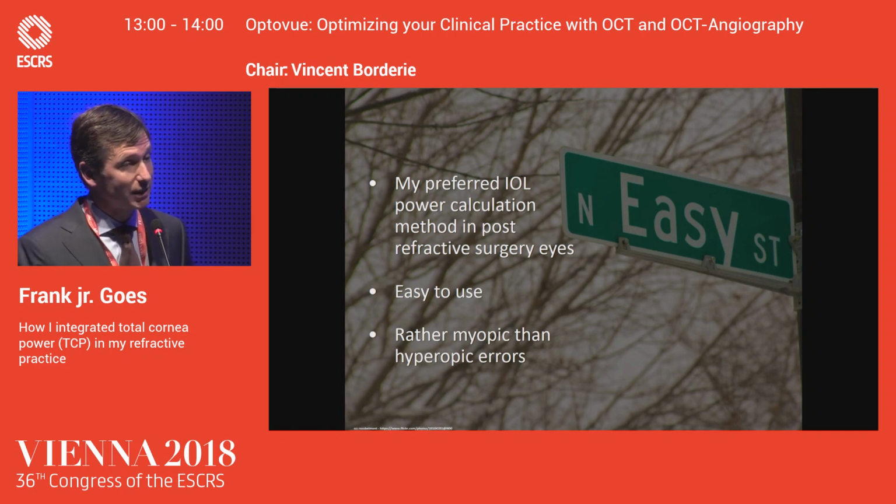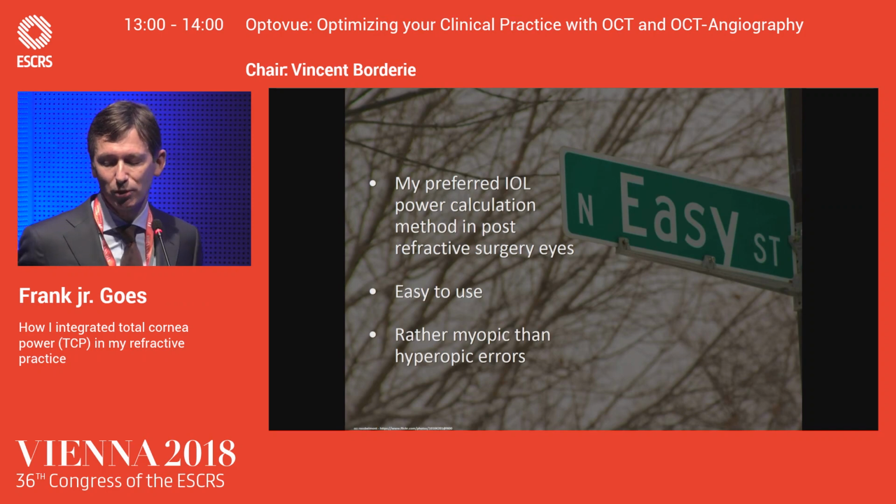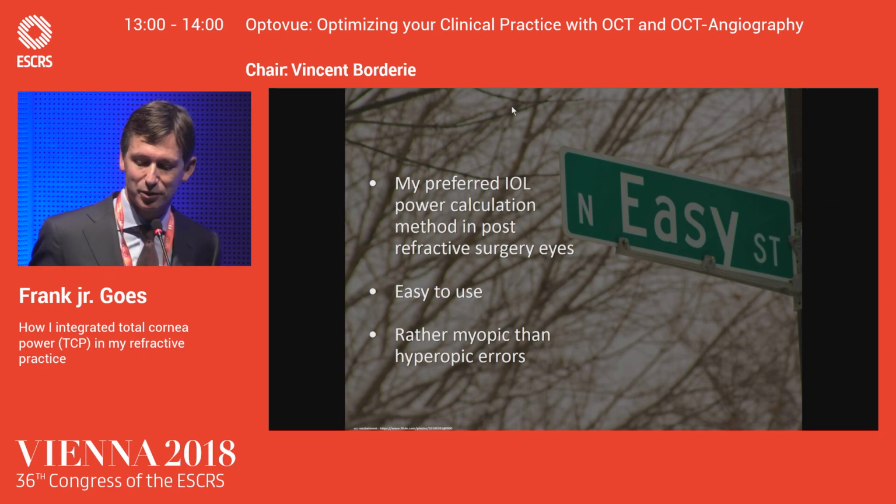In our hands and in this group, we rather had myopic errors than hyperopic errors, which is something that we prefer. If you don't have emmetropia, like all of us, we prefer some myopia instead of hyperopia. So in conclusion, at this moment, we really think that this method is the preferred method for doing IOL calculation after previous refractive surgery.